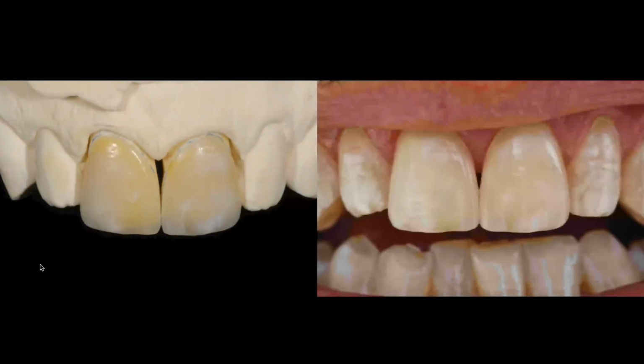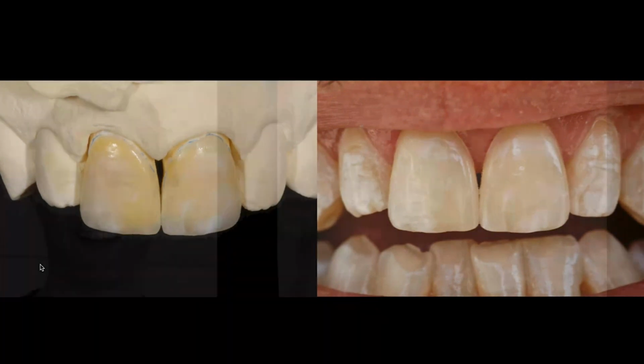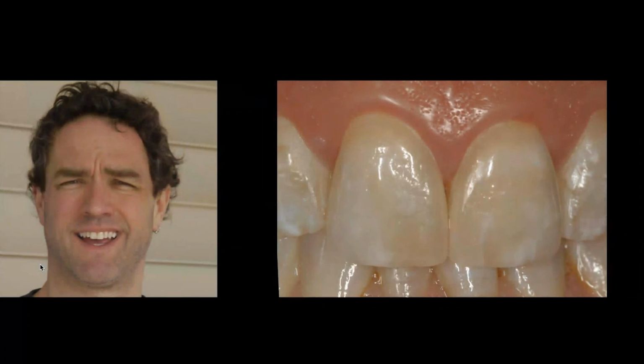I made 2 refractory veneers. You can see they're paper thin. You can see my yellow dye spacer coming through, and you can see all the surface and topography and white calcifications that I tried to blend in there. And then we'll place them intraoral, and you can see that that papilla didn't really fill in yet, but it started to fill in pretty quickly within the next 15, 20 minutes. So that was just managing the basic biology.